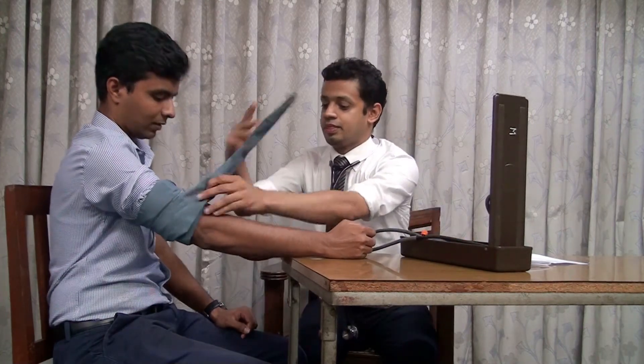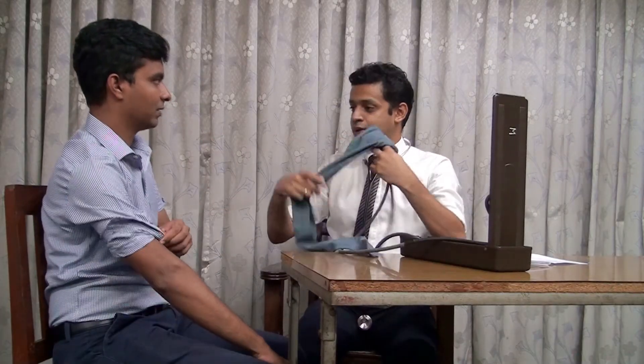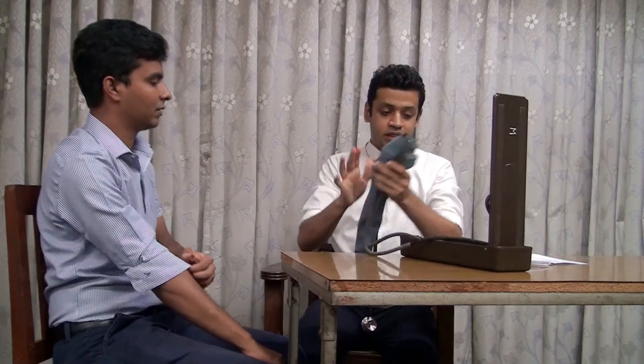I will take a little bit. So here we have demonstrated the correct technique of blood pressure measurement. So during blood pressure measurement, we need to use a validated calibrated sphygmomanometer.